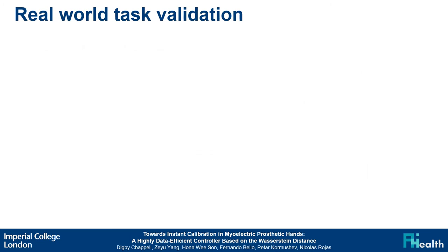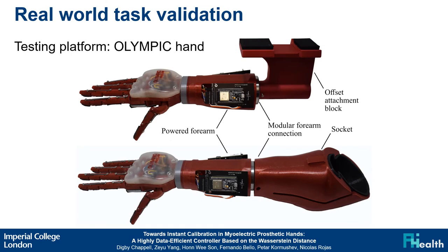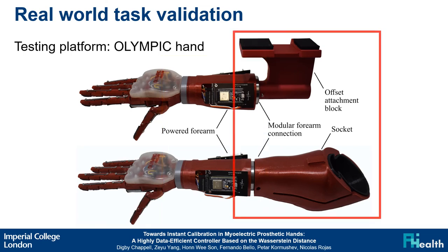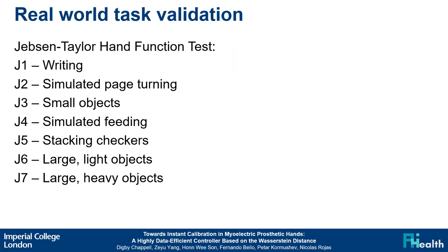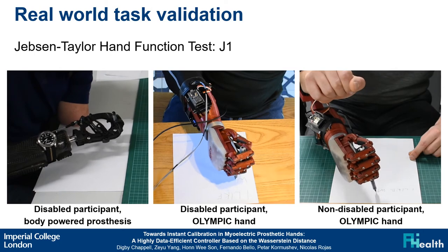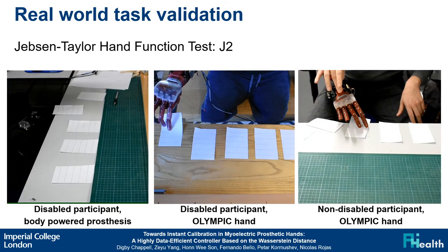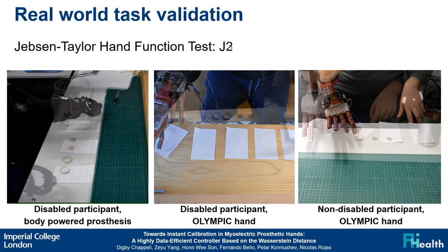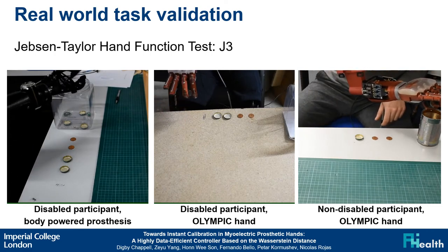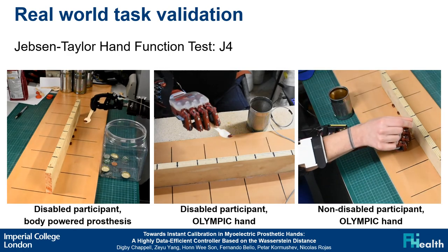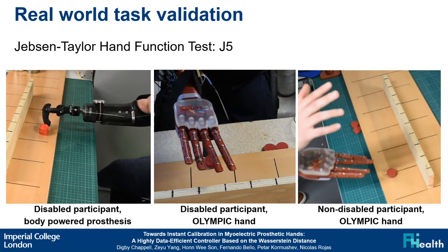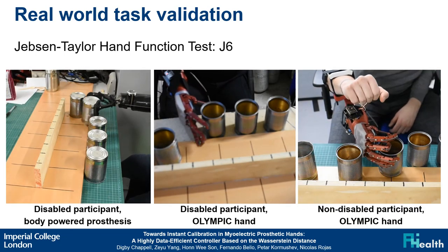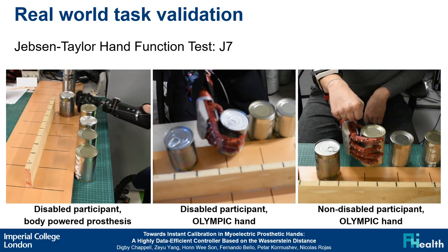The final experiment was to validate the controller on real-world tasks. We used the Olympic hand as a testing platform, with the addition of a powered forearm and a custom attachment block and socket for non-disabled and disabled participants respectively. Participants completed the Jebson-Taylor hand function test, which includes tasks designed to represent a variety of activities of daily living. Here we can see participants completing the first task, writing; the second task, simulated page turning; the third task, picking up small objects; the fourth task, simulated feeding; the fifth task, stacking checkers; the sixth task, picking up large light objects; and the seventh task, picking up large heavy objects.